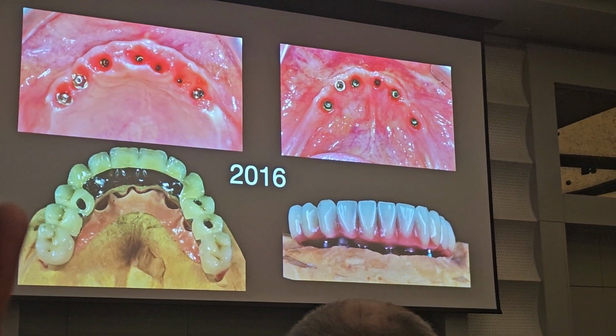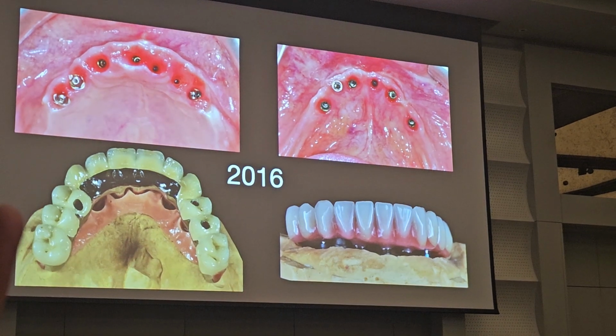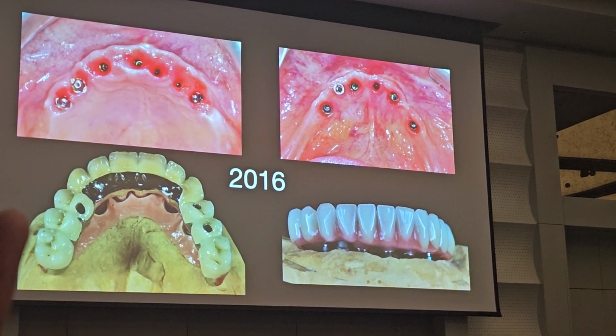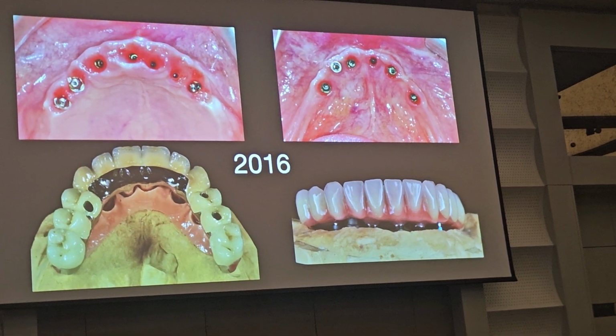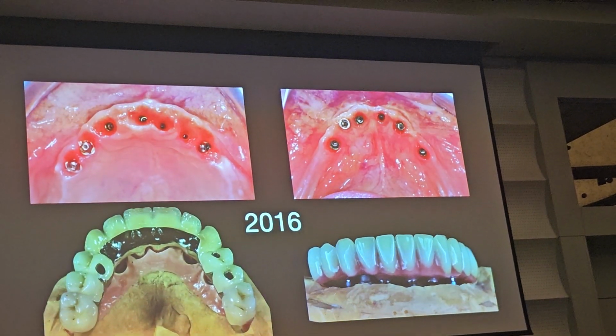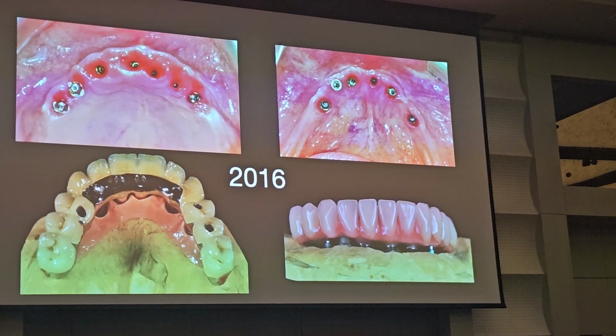So I plan everything perfectly. I did the metal ceramic in the upper arch, and we decided to do the lower arch in acrylic, just for creating a stress reliever for the upper ceramic. So we knew that we would have problems on the lower arch. But the patient has no problem on the upper arch.